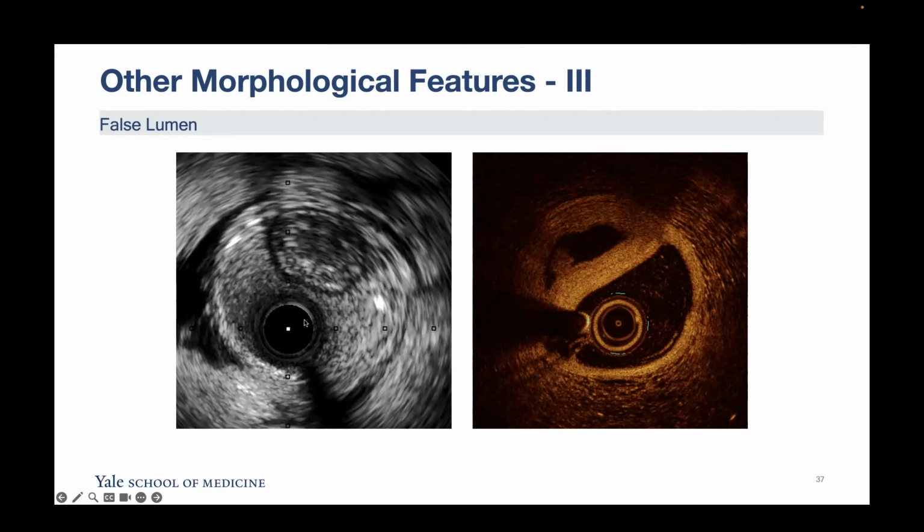So what I did, I waited for 2 months, and then when I imaged again, the true lumen had expanded back to its original position, and then I was able, using a workhorse wire, to just complete the case. So I just delayed my management for 2 months.